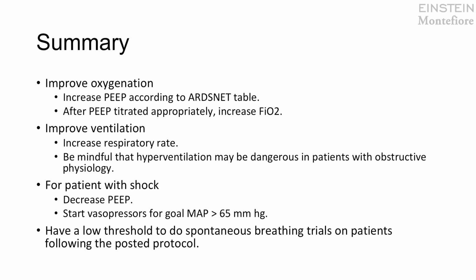In patients with ventilatory failure, respiratory acidosis, one thing we can do is increase the respiratory rate. We should almost never increase tidal volumes in patients, as this can be injurious to the lung. You want to be mindful, even when you increase respiratory rate, that hyperventilation can cause breath stacking and also cause impaired venous return in some patients who have obstructive physiology, such as COPD and asthma.